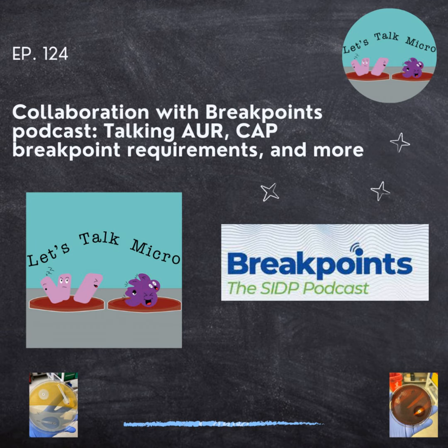I always recommend laboratories get those isolates and keep them, because they can become helpful when you need to do this type of validation. They already have MIC and some of the interpretation. But since the validation that has to be performed is a categorical agreement, one of the best methods to use as a reference is disk diffusion. Disk diffusion is a reference method, and also provides the interpretation of the breakpoint, that is a specific data set that will be used for the validation process.